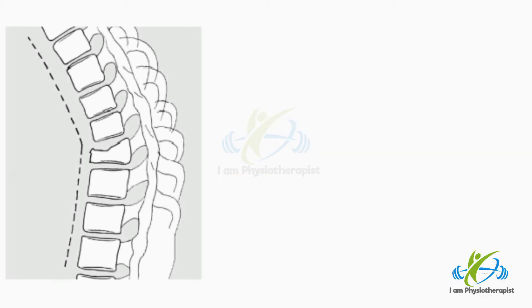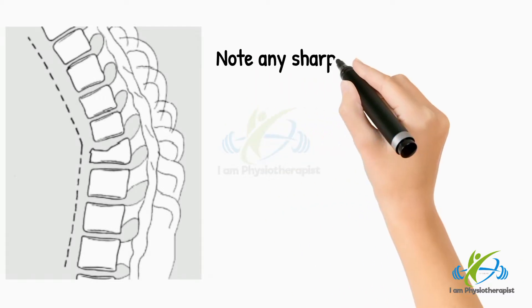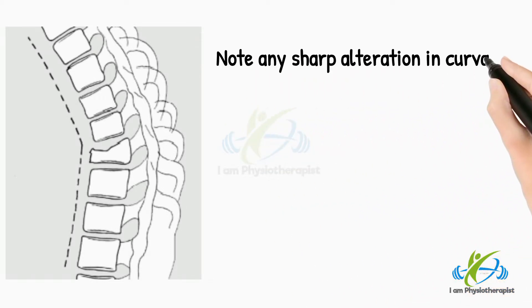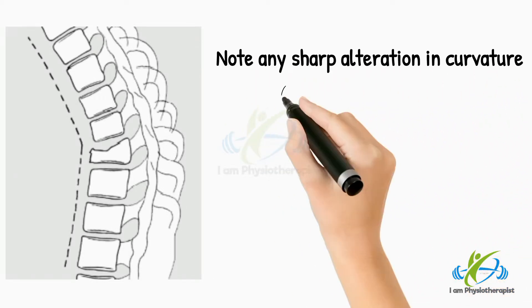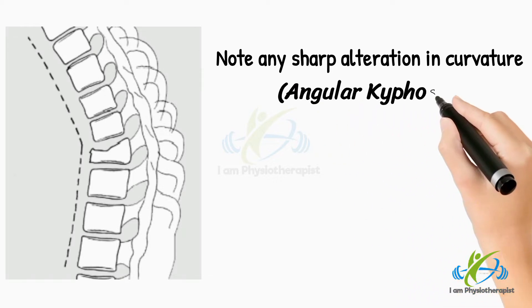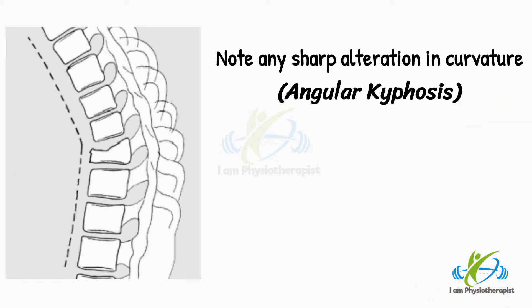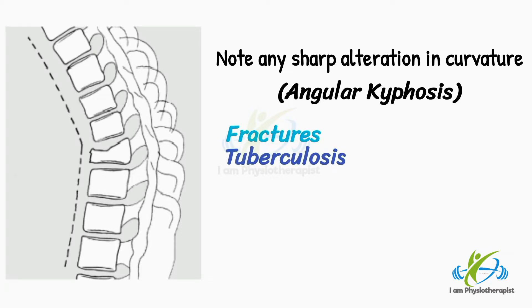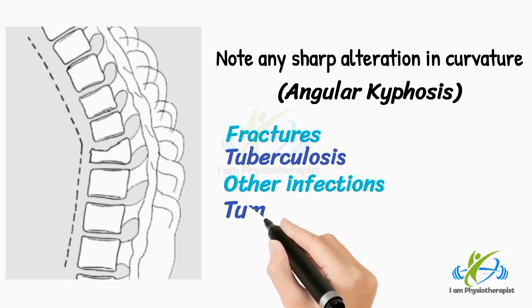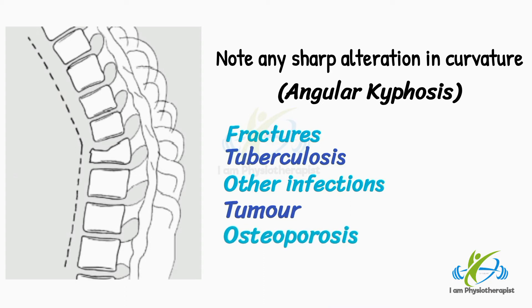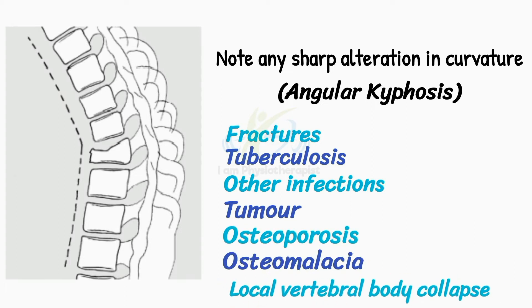In both the lumbar and the thoracic spine, note any sharp alteration in the curvature. Angular kyphosis is found typically where there is pathology restricted to one or two vertebral bodies — for example, from fractures, tuberculosis or other infections, tumour, osteoporosis, and osteomalacia with local vertebral body collapse.